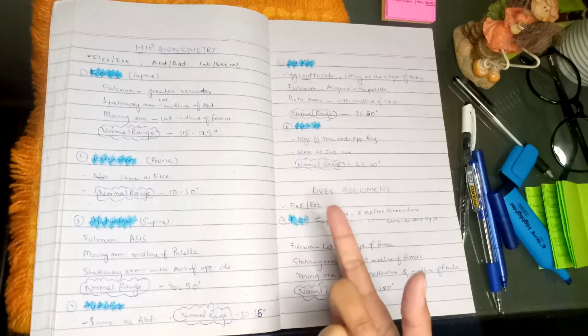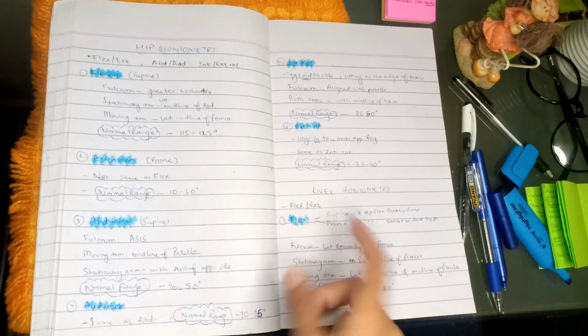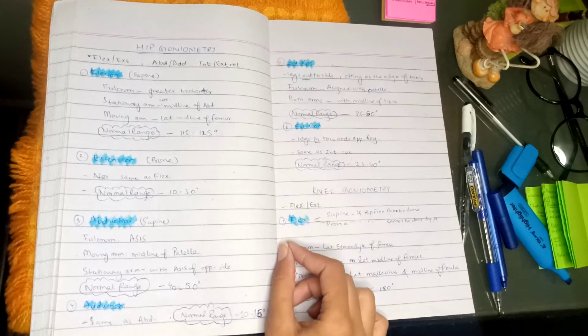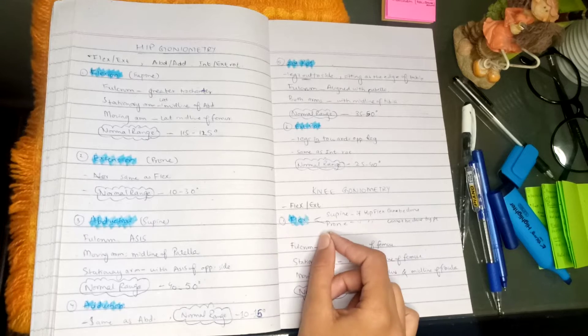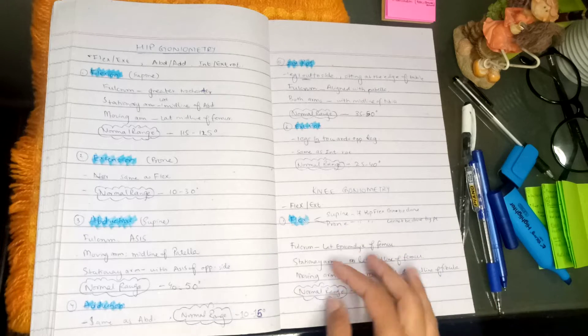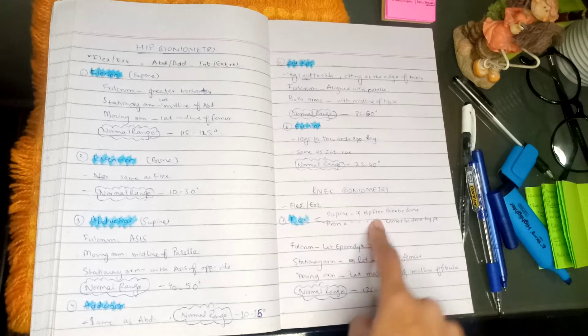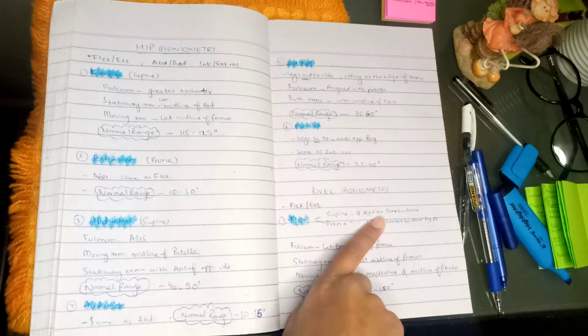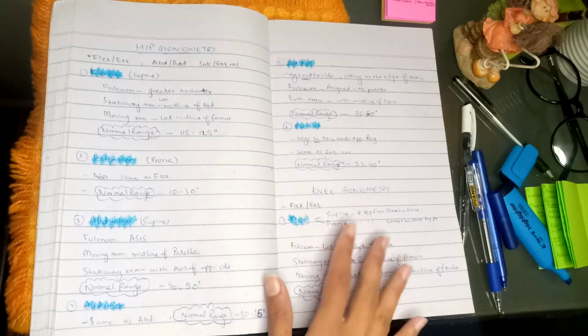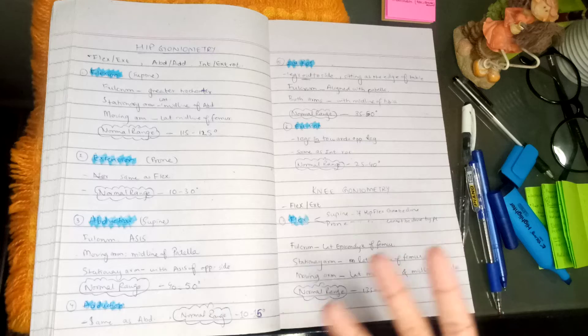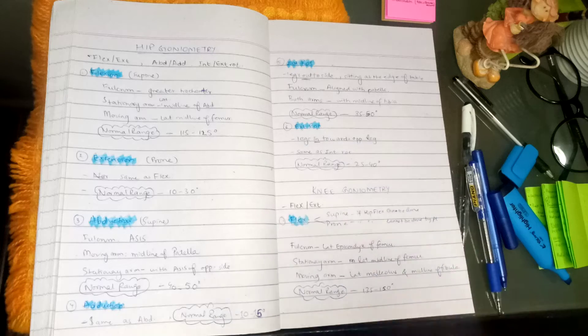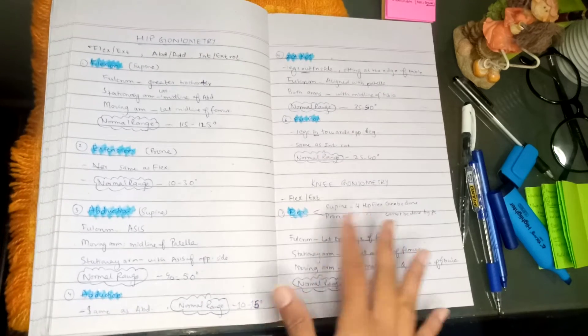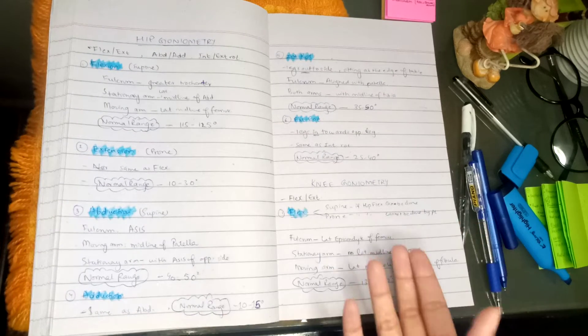In flexion, we have to do goniometry, so it depends on the patient. We can do it in supine position if they can flex the hip. Otherwise, if the patient cannot do that hip flexion properly or if they are uncomfortable, then we will take them in prone position.